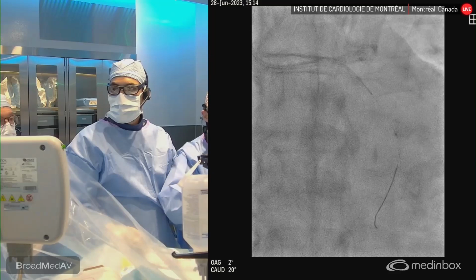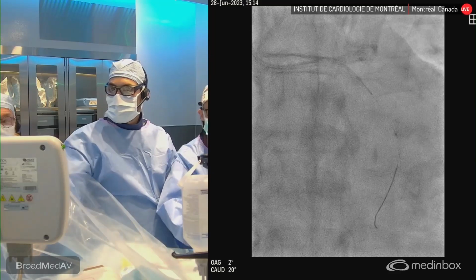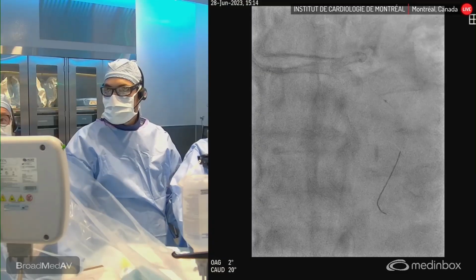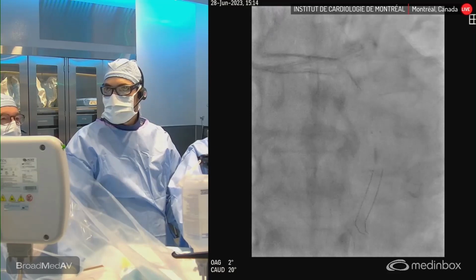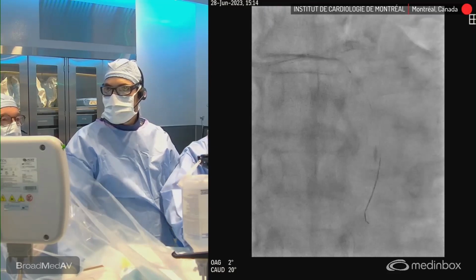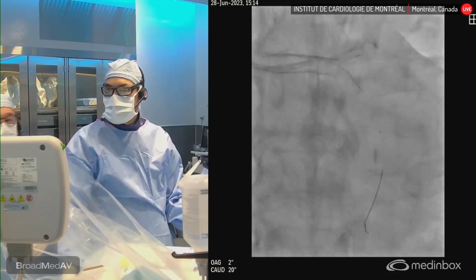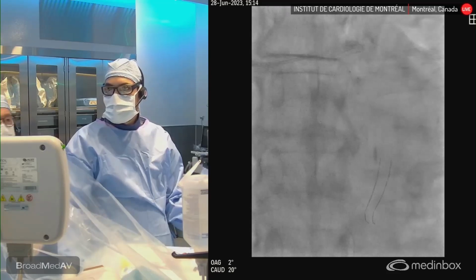Yeah, can you show the dilatation? The next slide. And retourne l'écran vers nous, s'il te plaît. Dilatation. Norelis, retourne l'écran vers nous. Okay, so that's the wire, the supercross. Okay, next one. Okay, to prepare IVUS.